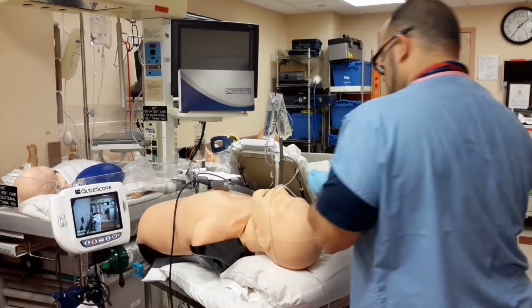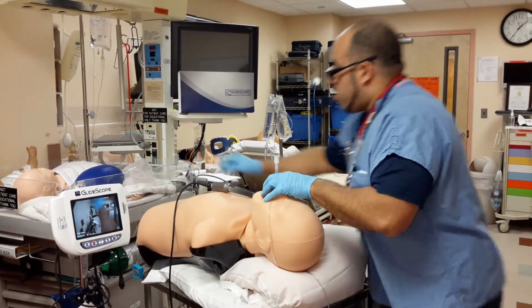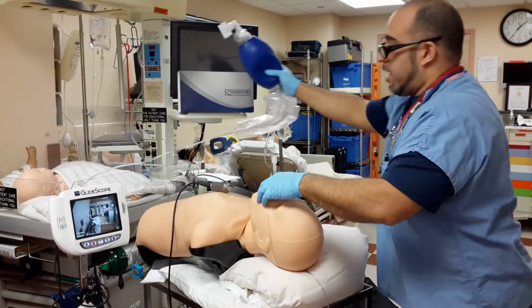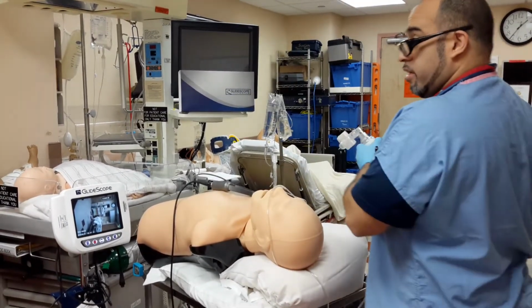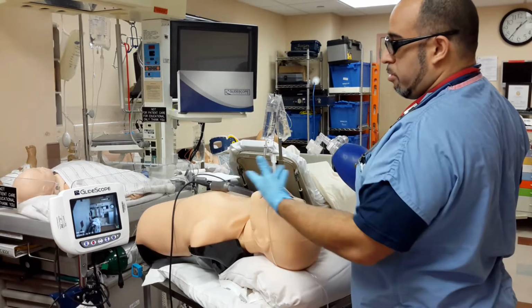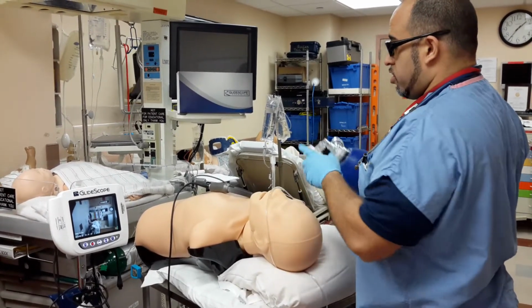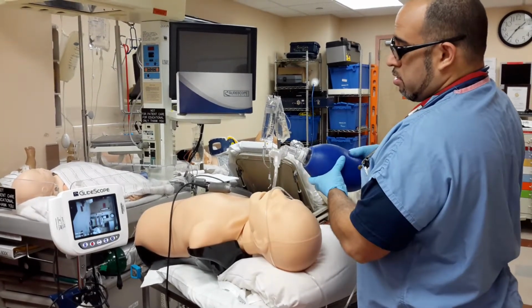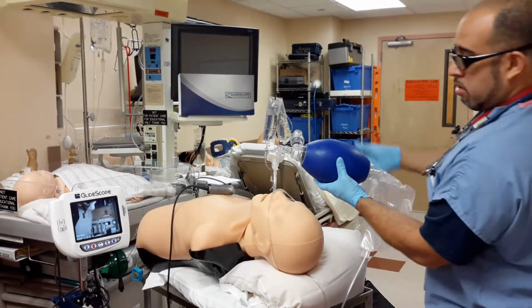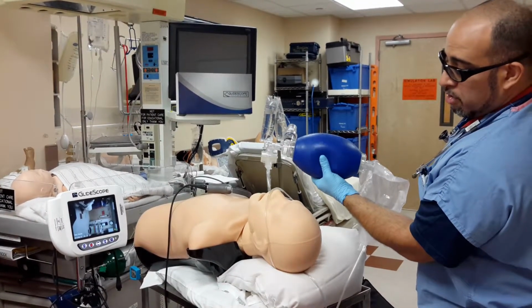We'll now inflate the cuff and use my very expensive Glidescope handle. But in real life I wouldn't, but just to confirm and to demonstrate on my mannequin, my Truman mannequin, that there is chest rise. I'm a believer it works.